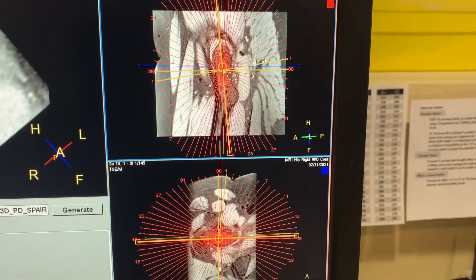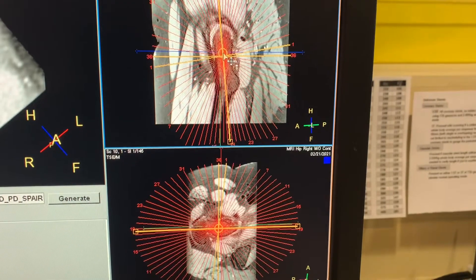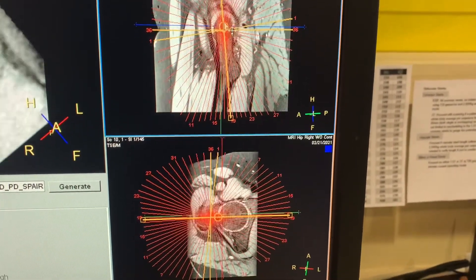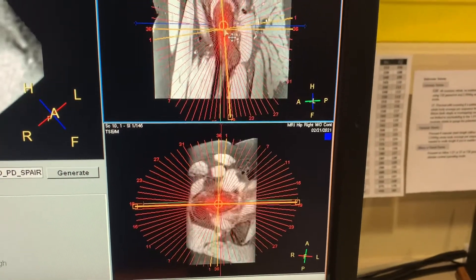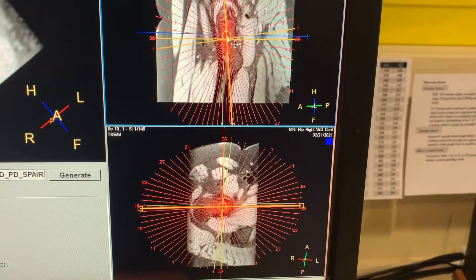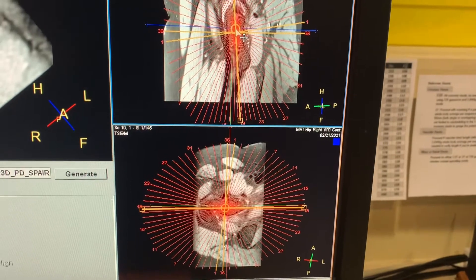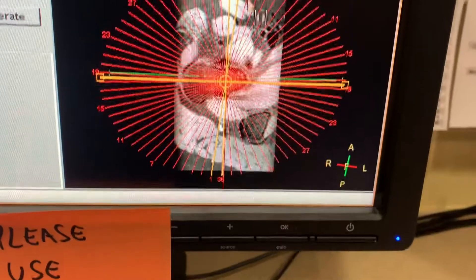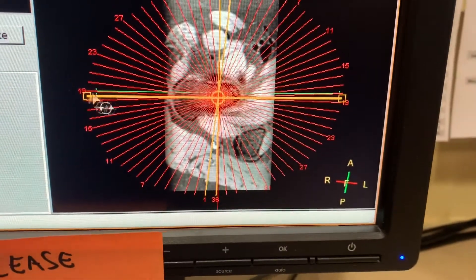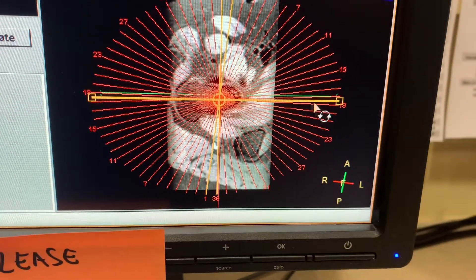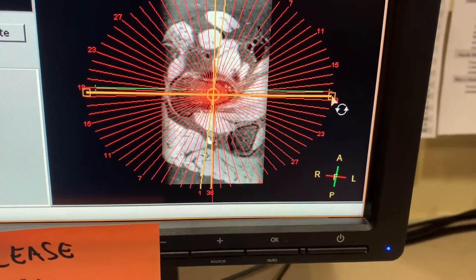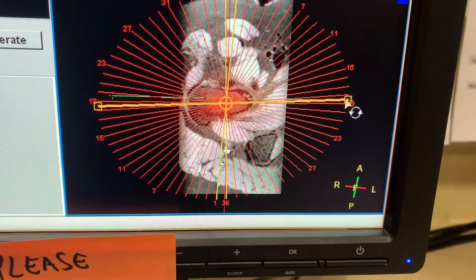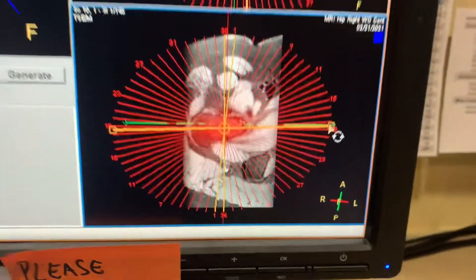To see the neck properly in the bottom image, grab the circle and move it up and down — since it's axial, moving it up and down lets you see the neck going in and out. Put it where you can see the neck pretty well, then angle the yellow line with the circle and square parallel to that neck really precisely.